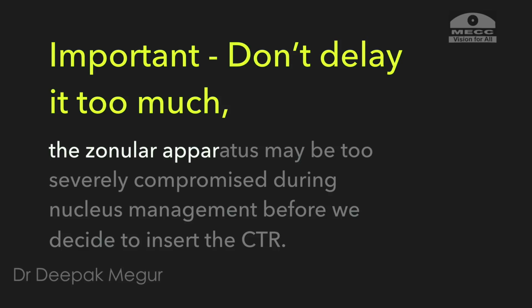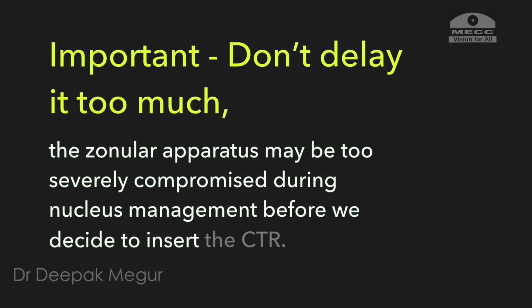The zonular apparatus may become too severely compromised during nucleus management before we decide to insert the CTR. Hence, timing is critical, and when in doubt, insert it as early as possible.